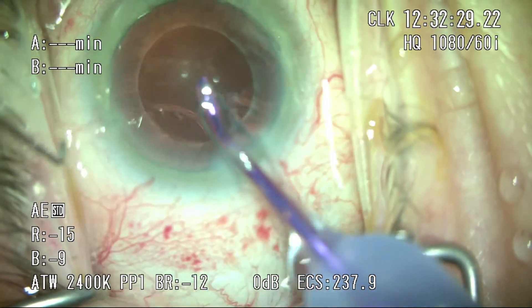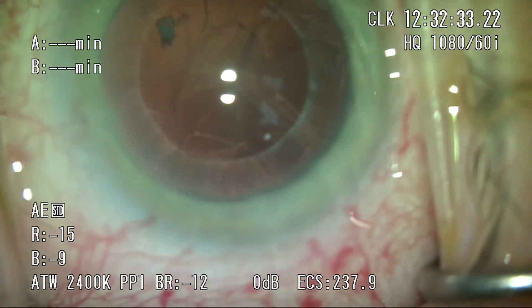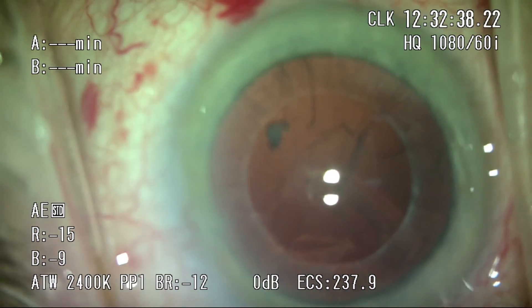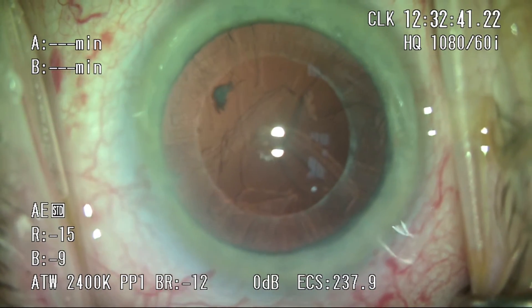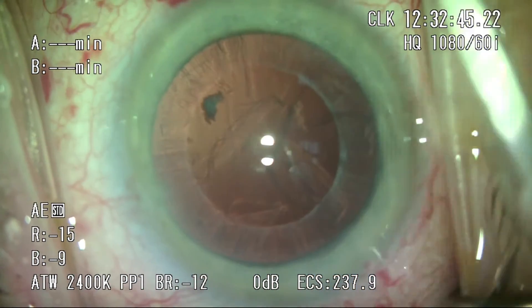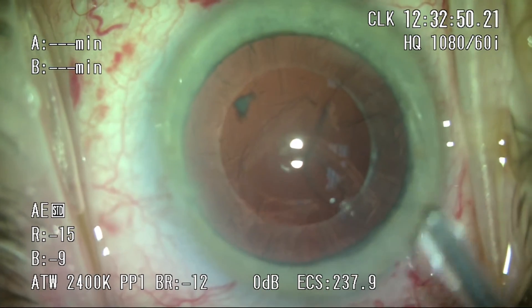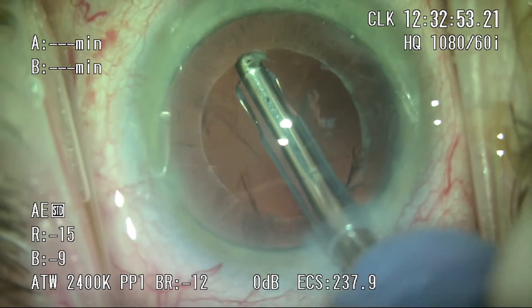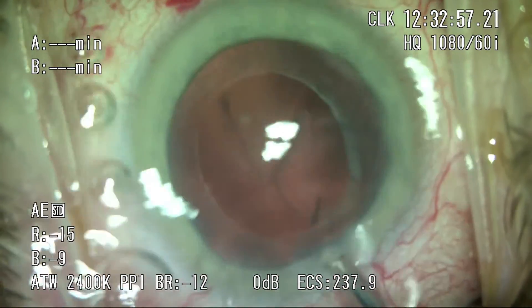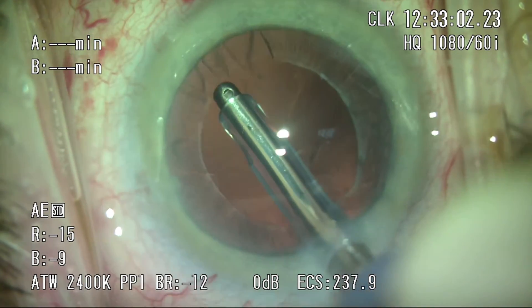There's a bit of a posterior plaque, and switching over to the epinuclear mode, I'm able to gently manipulate it into the phaco tip and tease it out. One challenge with irrigation and aspiration in these cases is that there are no wisps of cortex extending beyond the anterior capsule to pick up easily with the IA tip. However, we haven't seen fusion of the cortex with the anterior capsule as described on other femto platforms — once you get underneath the anterior capsule, the cortex strips very easily and leaves no remnants.